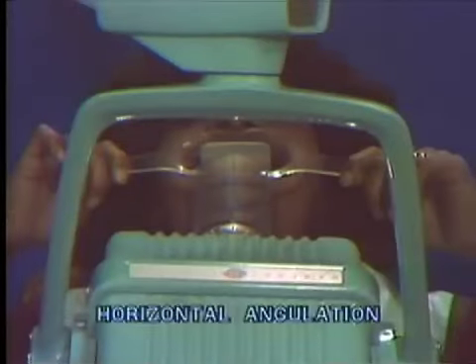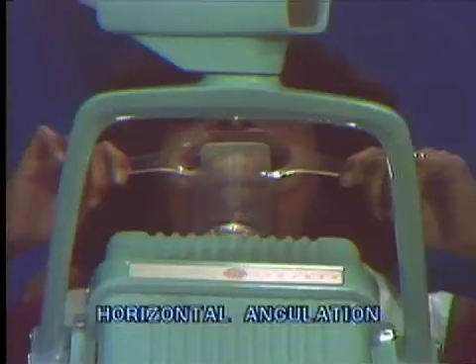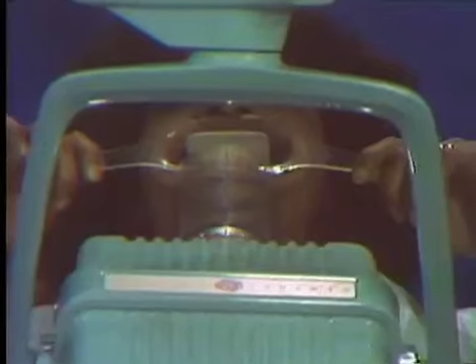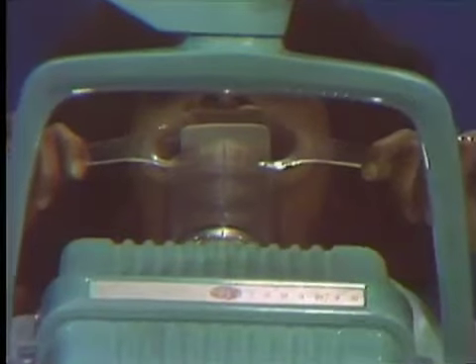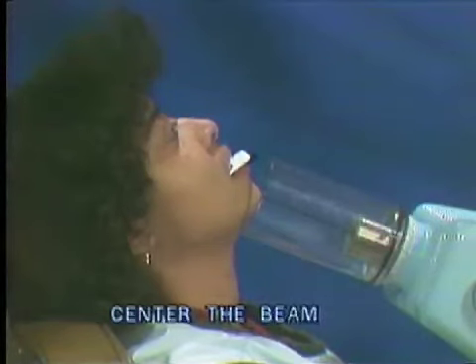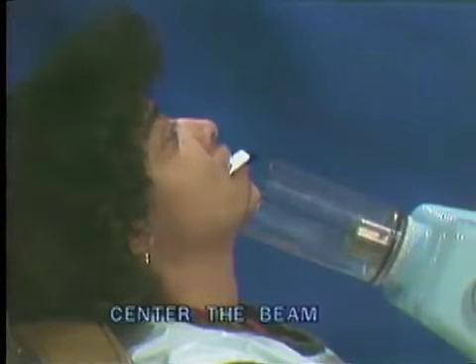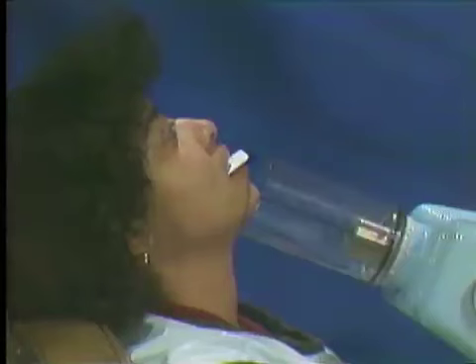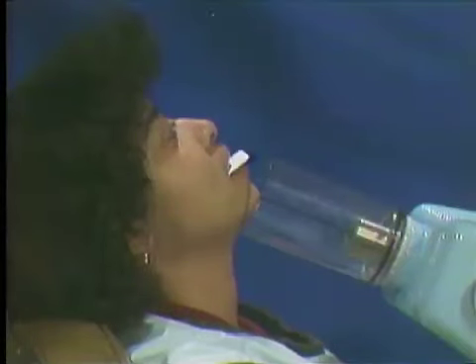The horizontal angulation follows the median sagittal plane. Usually the contacts between the mandibular central incisors will be opened. The beam is centered over the film by directing the central ray along the median line of the chin at the apices of the mandibular central incisors. Before the exposure is made, the patient is asked to close the lips.